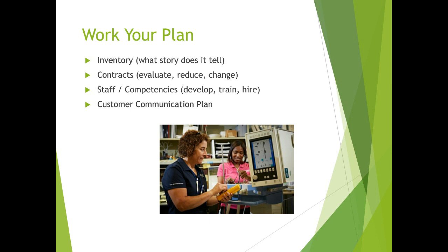Can you have a first look? Do you have the people that are trained? I suggest when you're looking at some of the larger vendors, put a roll-down process in there. So as your folks get more experience, more training, you can take some of the devices from a full service to a first look, or whichever level that is, and evaluate that at least annually, preferably semi-annually, to be able to roll that down and then bring more cost consideration to your organization.